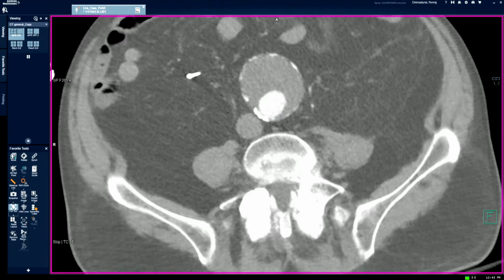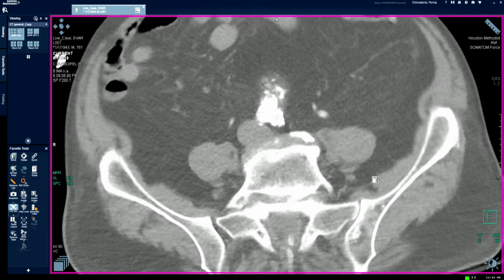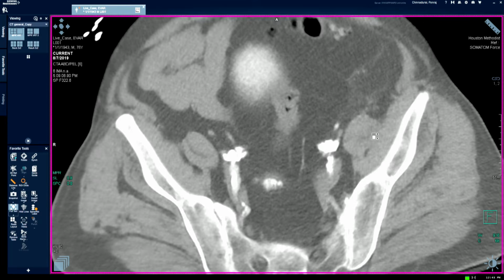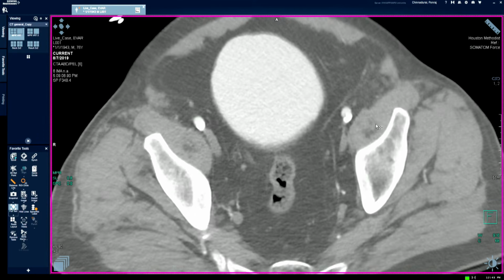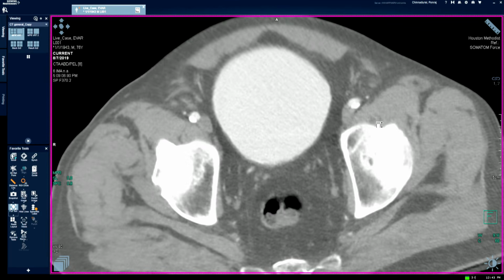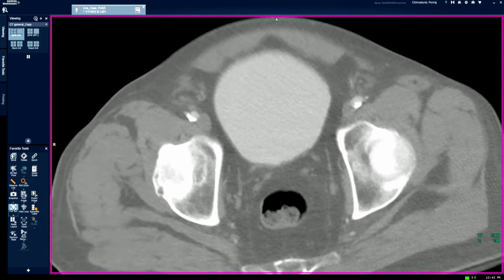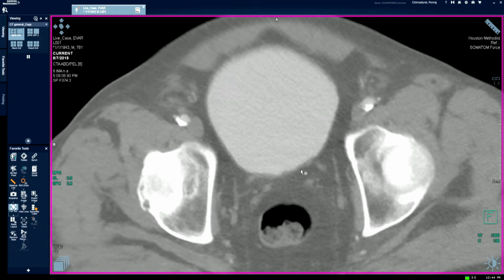Okay, so we are already in the aneurysm. I'm coming down. I can go slowly if you would like. So that's the bifurcation. Okay, which side do you want to go? There are only two choices. I think right. Why do you say so? Less tortuous on the right side, okay.